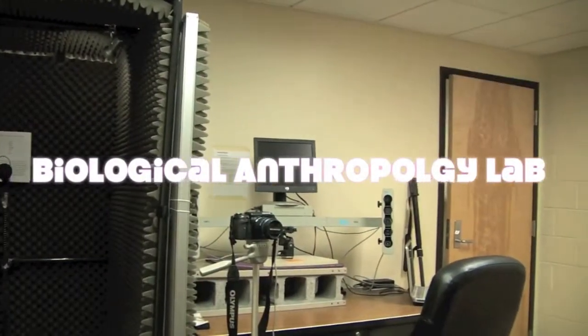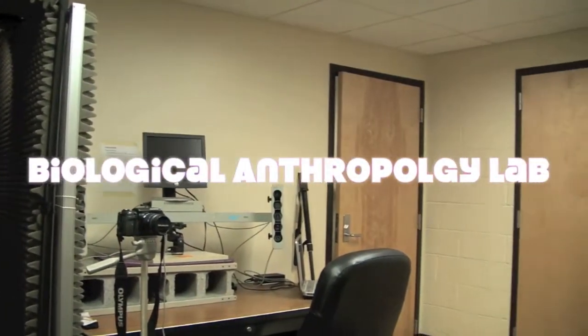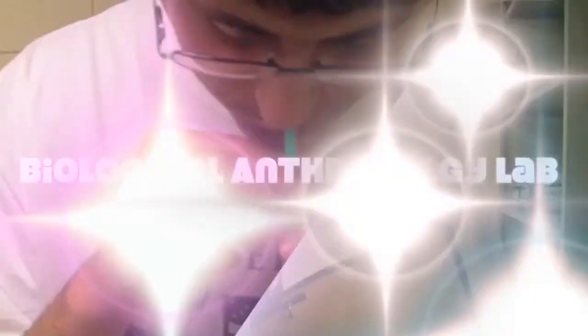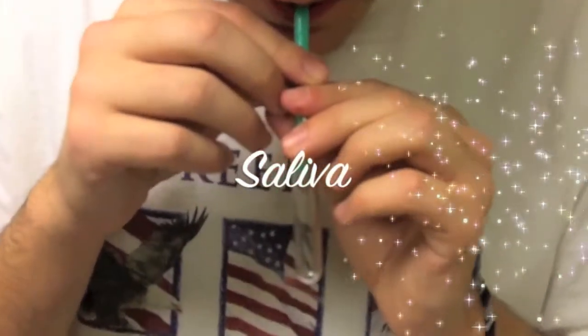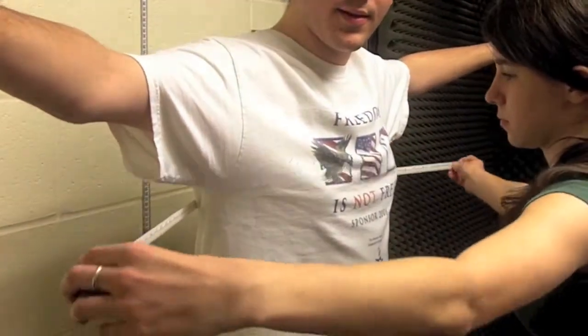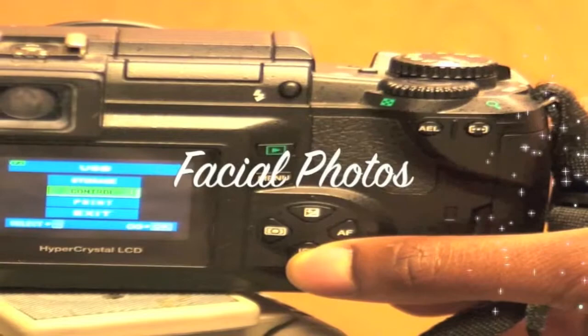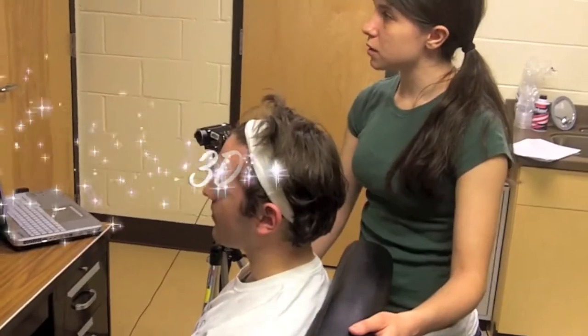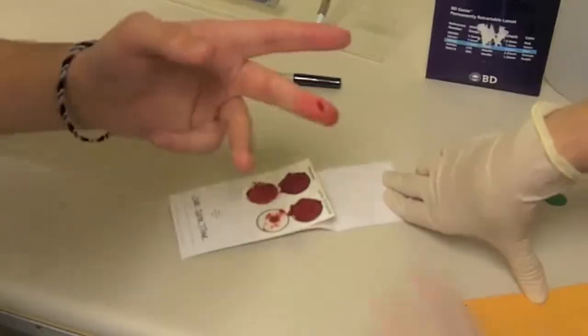Welcome to the Biological Anthropology Lab. Today you will learn how to collect samples of various biological measures. These techniques include how to collect saliva, how to take various anthropometric measurements, how to take facial photos, how to capture a voice recording, how to use a three-dimensional camera, and how to obtain a DNA sample.